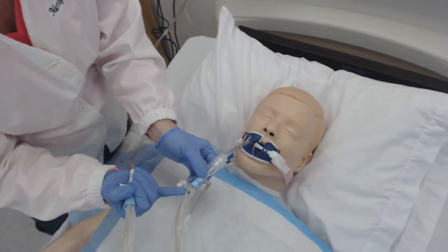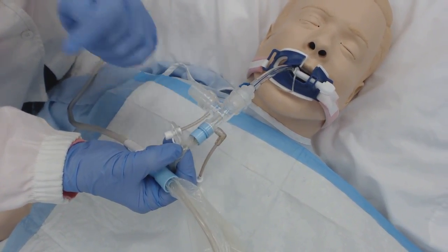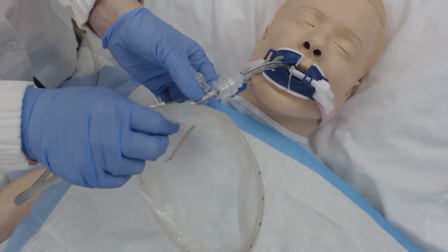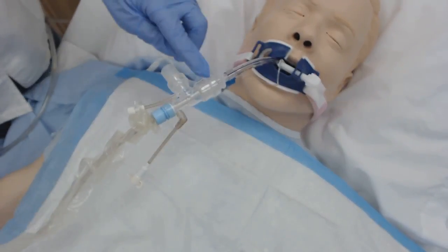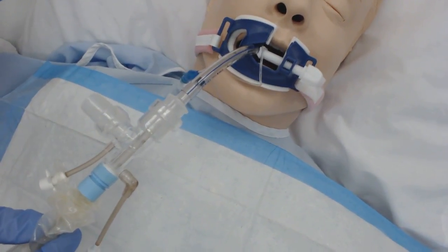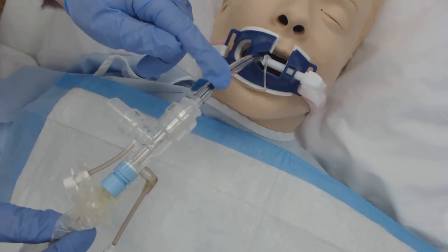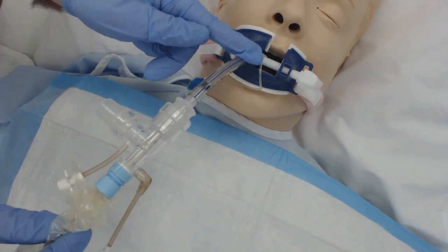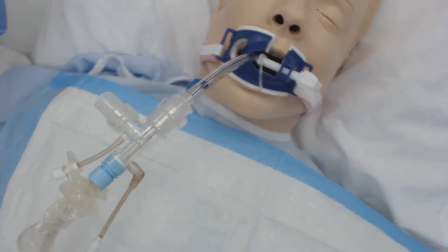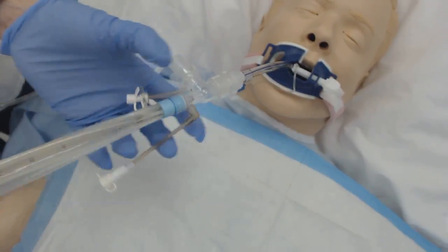Do you see this black line right here? This tells you that the suction catheter is back in its housing — it needs to be all the way up here. If you leave it partway, can you see that black line? The suction is occluding most of this endotracheal tube, which means you are causing hypoxia to this patient. That's why it's very important that it's all the way out so you can see that black line.